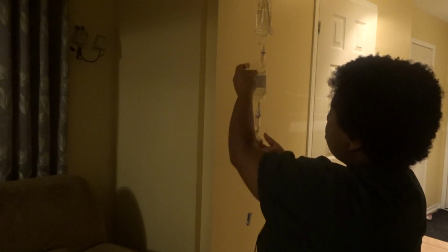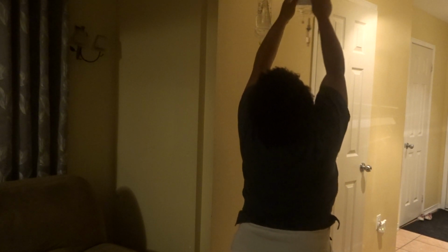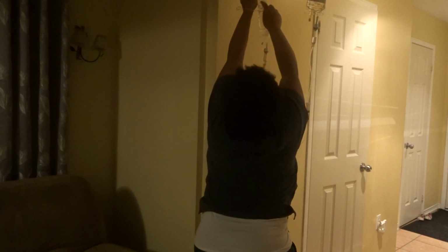Okay, perfect. Then I'm gonna go ahead and hang my medication bag. I'm just gonna go ahead and drop the mainline bag.